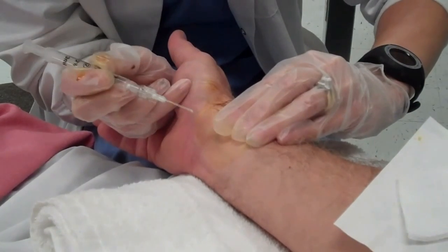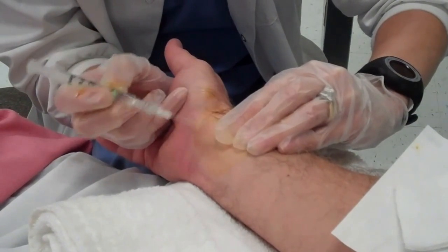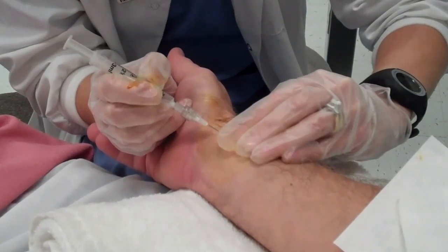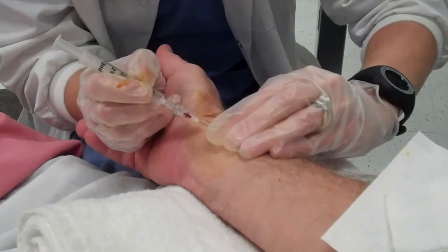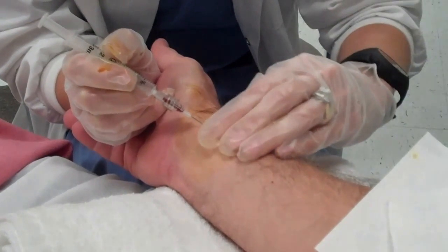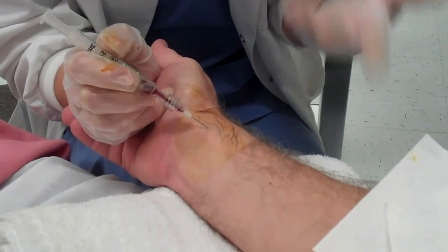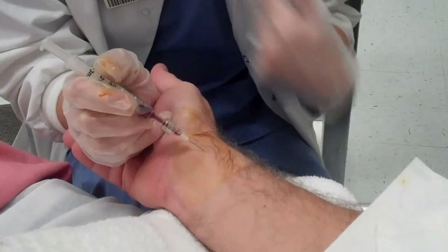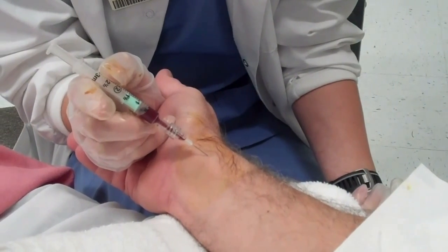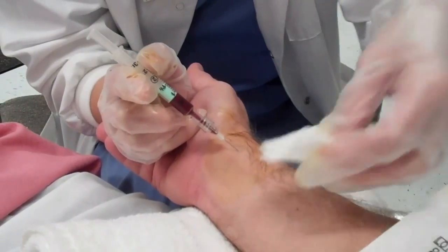At this point I have palpated. Mr. Dunphy, are you okay? I'm getting ready for a big stick — I'm coming in. I have my flash of blood. I had to push back in; we started to flow and it stopped — I wasn't deep enough. So our syringe will fill. We'll let that completely fill. Color looks good here, which is what we're looking for.